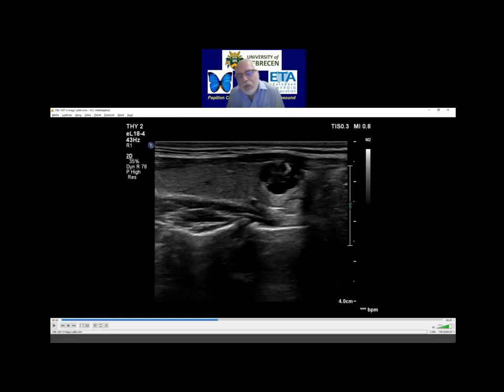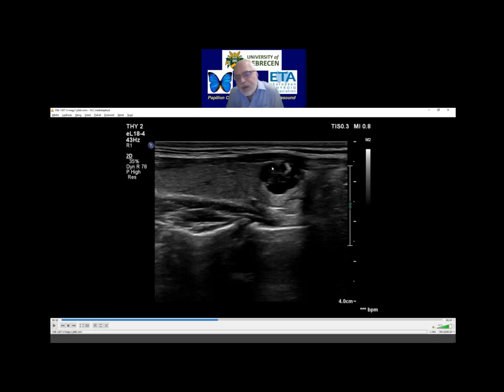This nodule presents two of the possible three signs of extra-thyroidal extension. The first is the abutment — meaning the nodule is in close contact with the thyroid in a quite large proportion. The second is that the capsule is discontinuous. The third is the abutment such that it merges with the nodule. This nodule shows two of the three possible signs of extra-thyroidal extension, but this was a benign nodule.